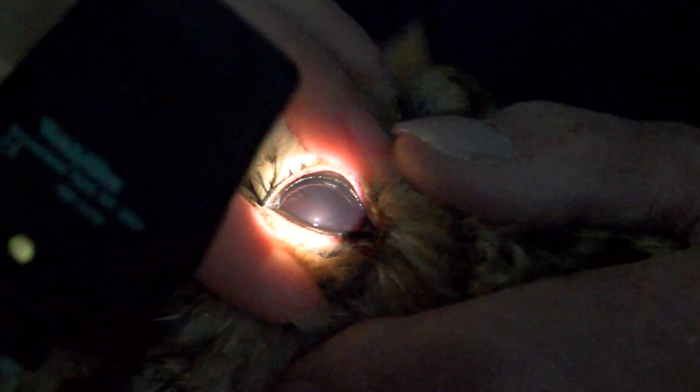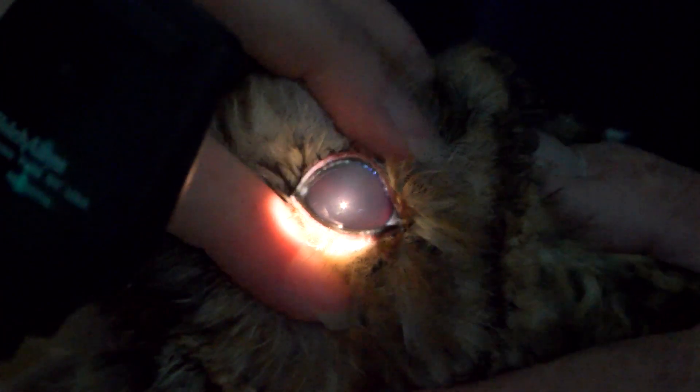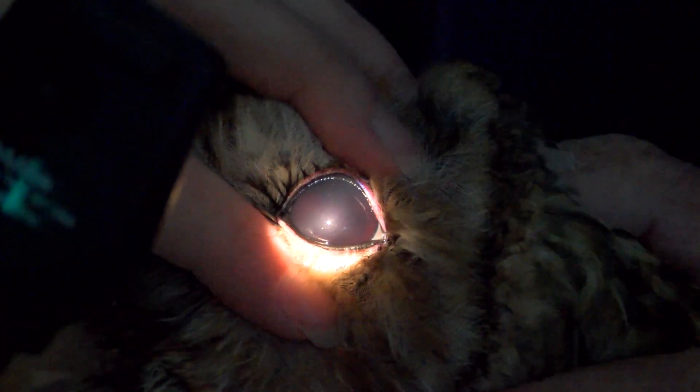You can see that. Still a lot of blood in there isn't there? So you can't really see the iris at all? Nothing.